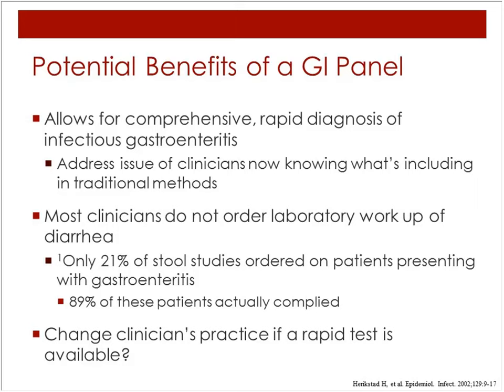these stool studies were requested, and only 89% of these patients actually complied and returned a sample. Another interesting finding was that the patient's clinical presentation and the costs were really not associated with or hindering test requests from the physician's perspective. Rather, the main reason why cultures were not being requested was that the test was not likely to yield a pathogen from the physician's standpoint or to alter the chosen treatment. So therefore, the increased sensitivity or comprehensive targeting of the FilmArray GI panel may address some of these shortcomings.